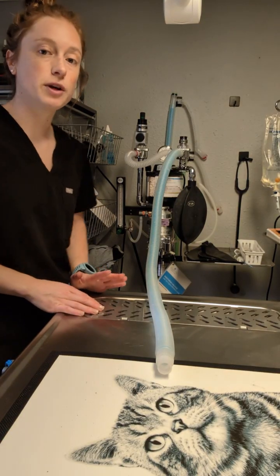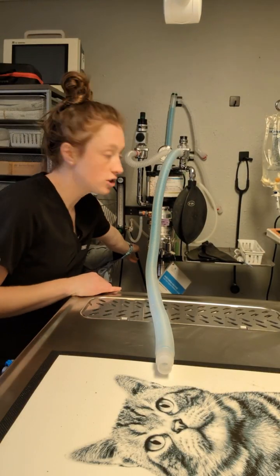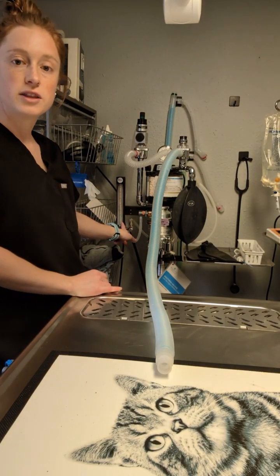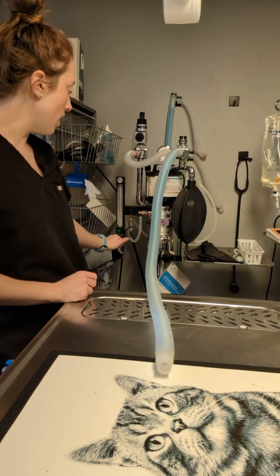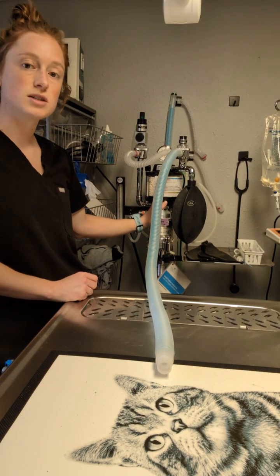Our main breathing circuit that we use is a rebreathing circuit. When the oxygen enters from the green tubing behind our surgery cart, it goes directly to our oxygen flow meter. This can be adjusted to change the amount of oxygen that we're delivering into the system via this green knob. We also have a button here, and this fills the system with the oxygen.